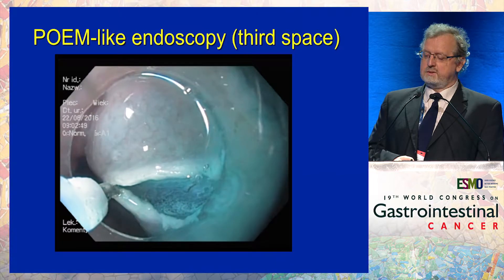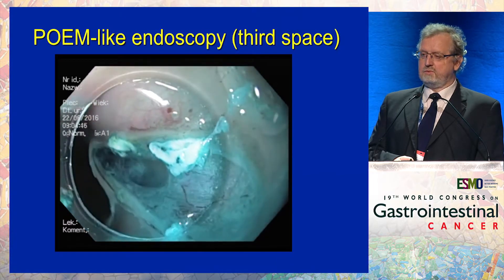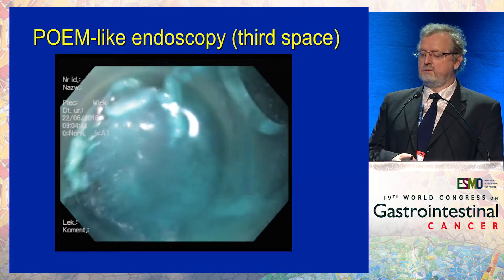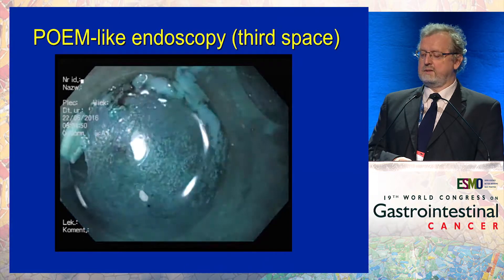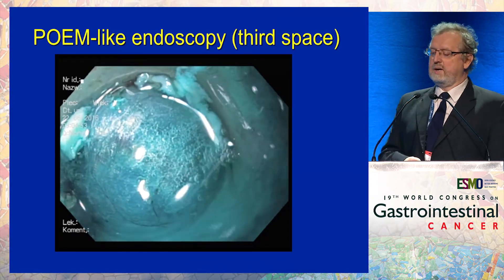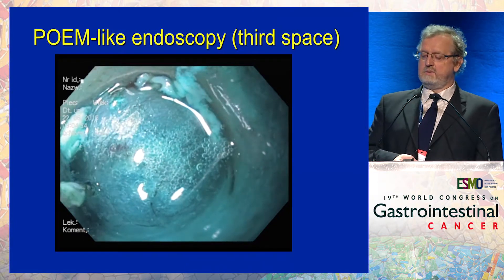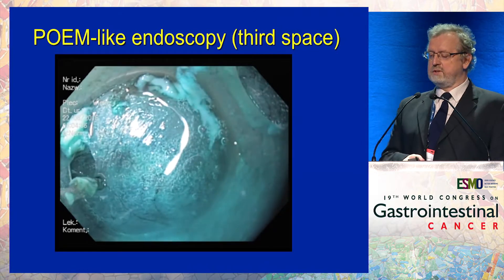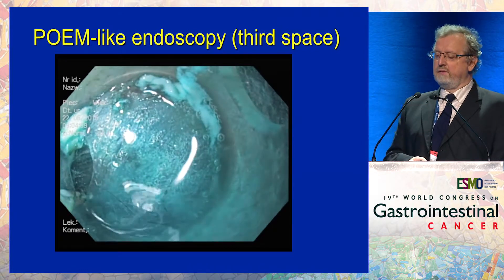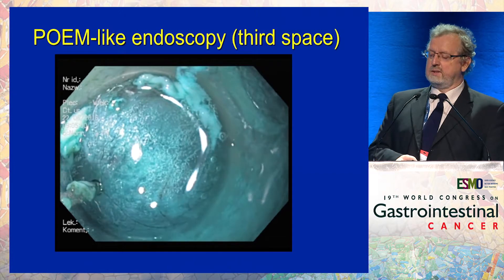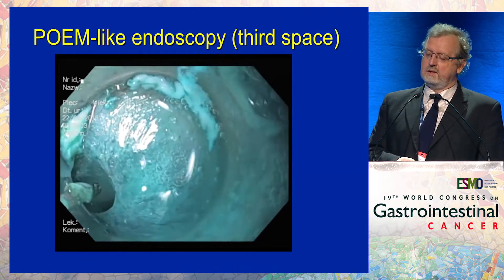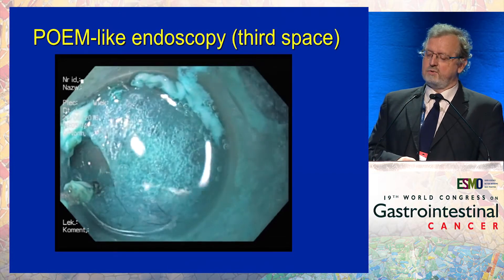Because we are cutting through the watery space, it comes quite easily. There is a lot of connective tissue — very soft — and we are cutting through that. On the right side you can see the muscle layer; on the left there is the submucosal layer.